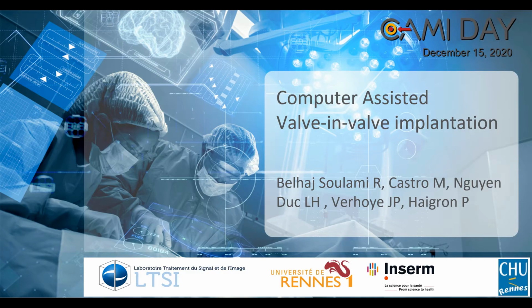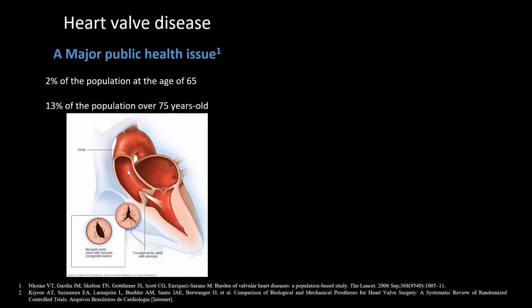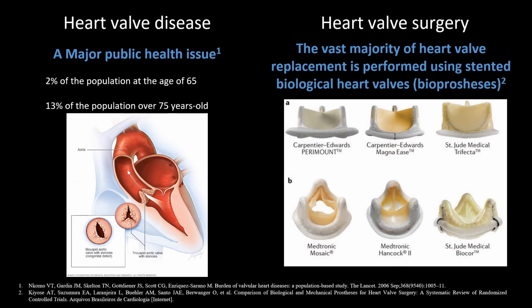In this video, we present the clinical application of computer assistance. Heart valve disease is a major public health issue, with over 13% of the population over 75 years old presenting significant valve disease. Currently, the vast majority of heart valve surgery is performed using biological heart valves, also called bioprosthesis.